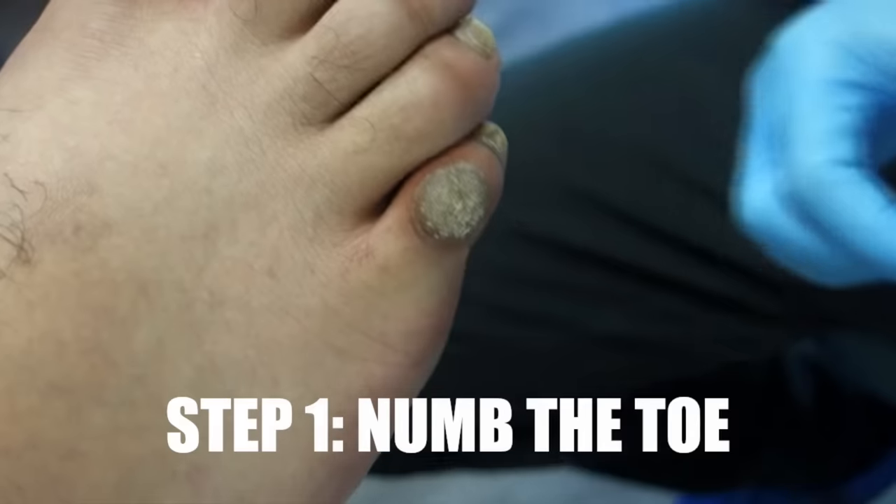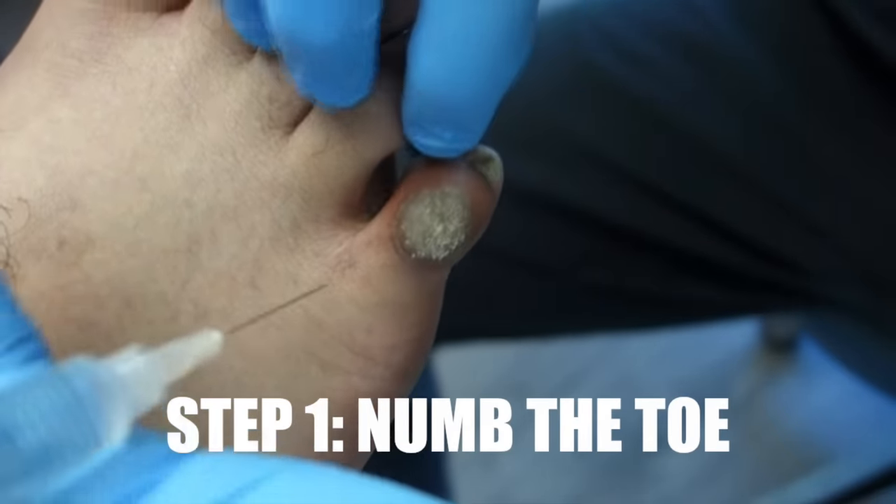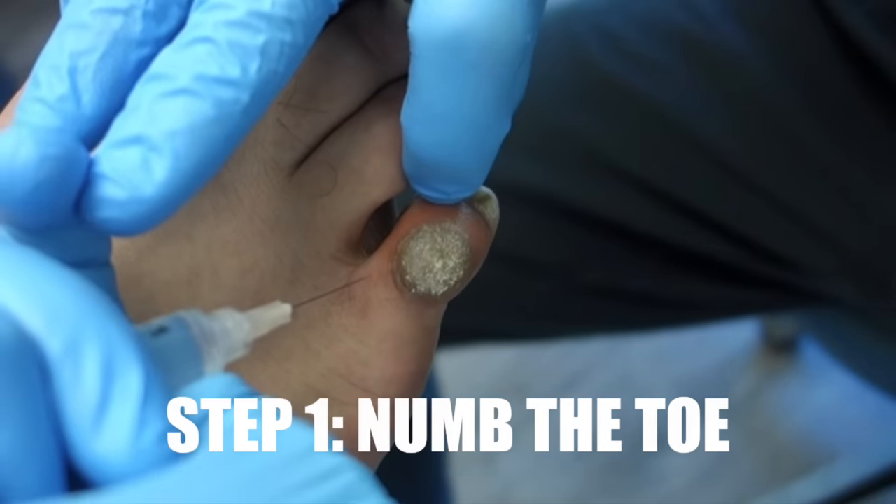I'm just wiping down the area. Okay, so here we go. Three, a pinch. One, two, three.